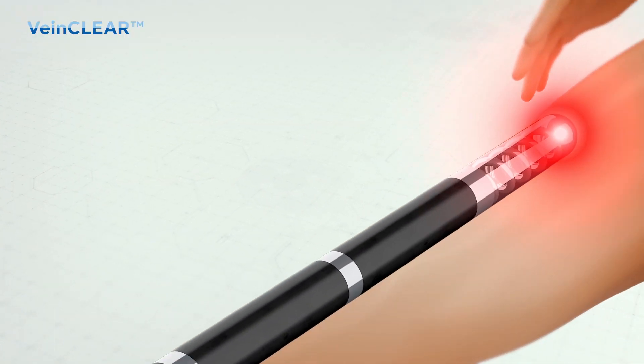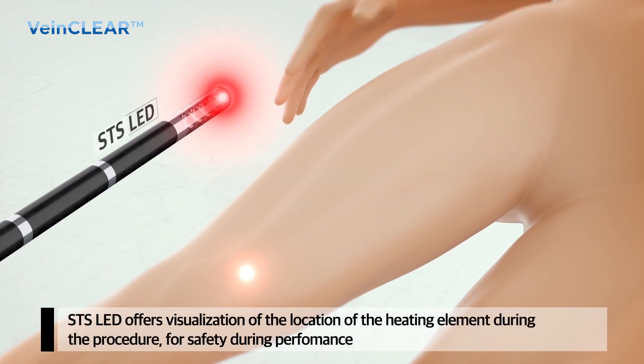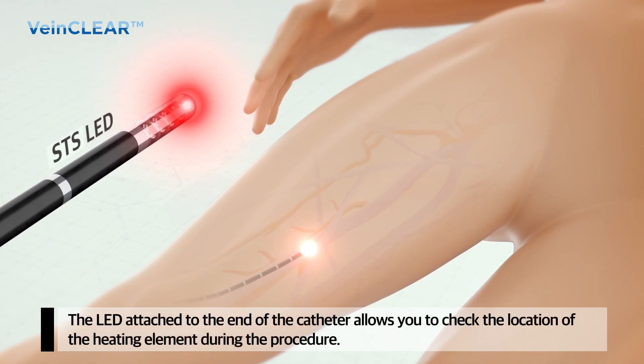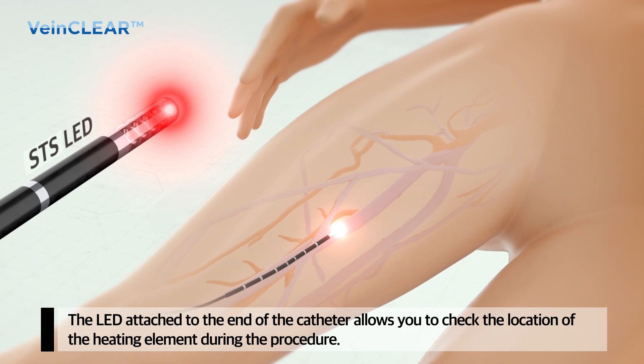The LED light attached to the end of the LED catheter allows you to locate the distal end of the heating element during the procedure with ease, thereby enhancing the safety of the procedure.